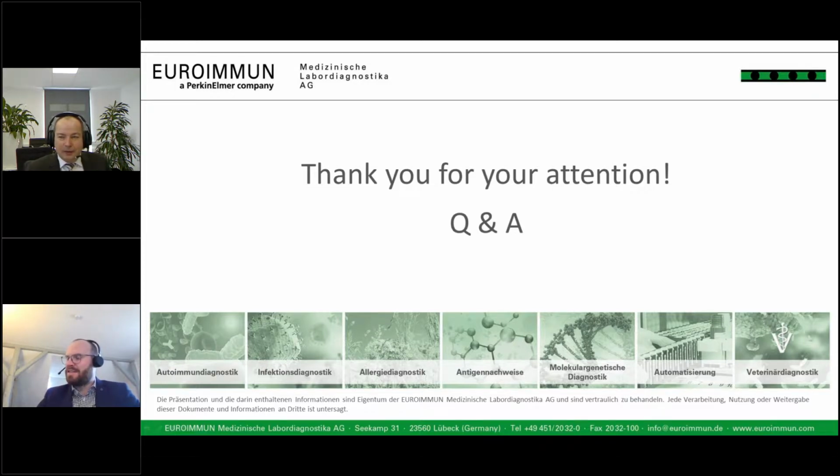Another individual asked, on your biochip slides, you showed the combination of granulocytes and Hep2 cells. Why do you combine these in one slide? What's the advantage? It's very good diagnostic samples. It's a lot of advantages because you see at the same time the information about your autoantibodies, granulocyte antibodies and ANA interferences. And you can recognize if you have atypical, if you have ANA.